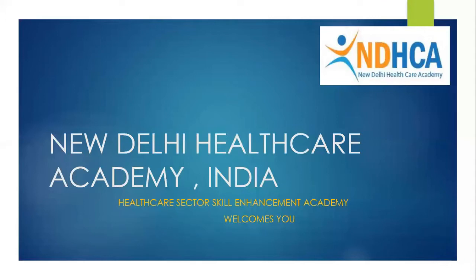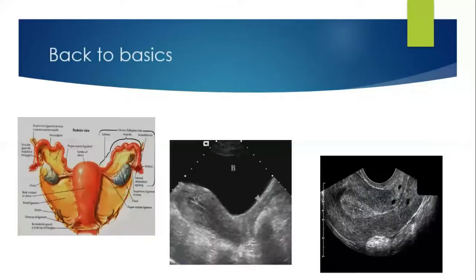And maybe for them, this is the second class, but those who are joining us or maybe listening to us for the first time will have an understanding of how we go in-depth teaching on a particular subject. And today we are going to teach on ultrasound anatomy of normal gynecology. Okay, now let us see this.